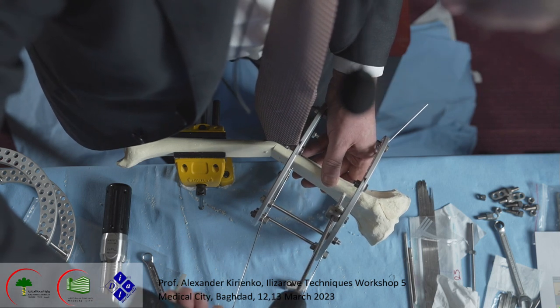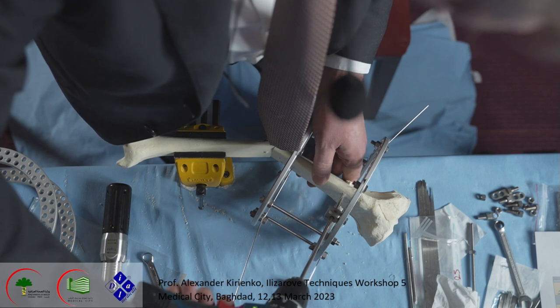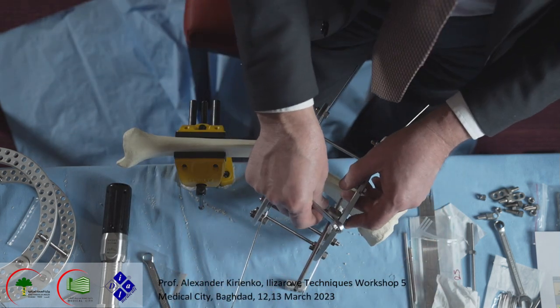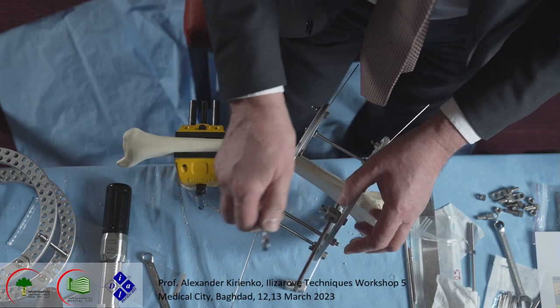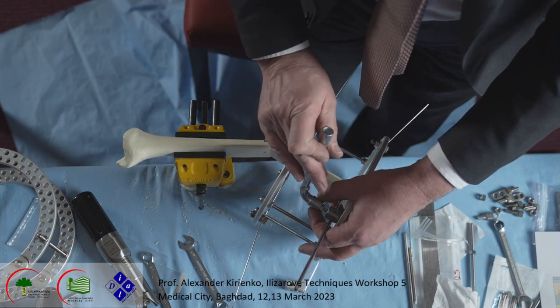Perpendicular. Small bolt. Fixed system.